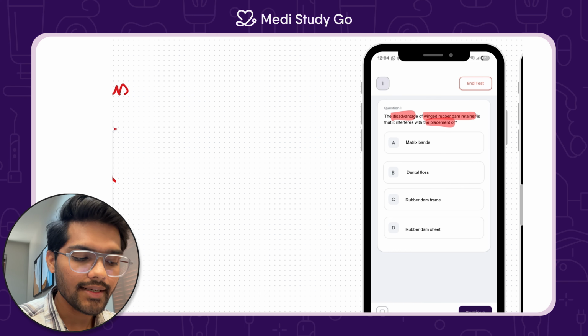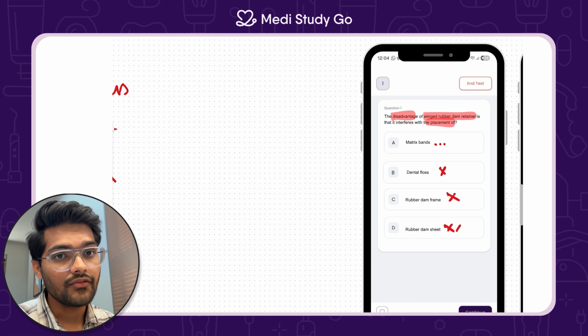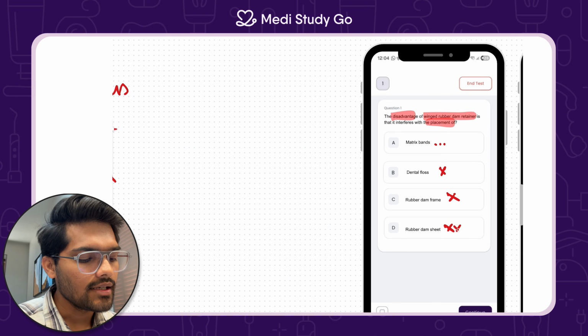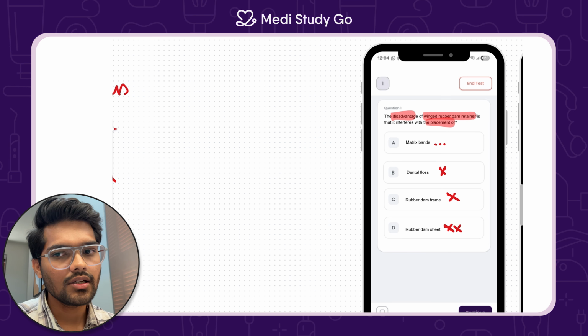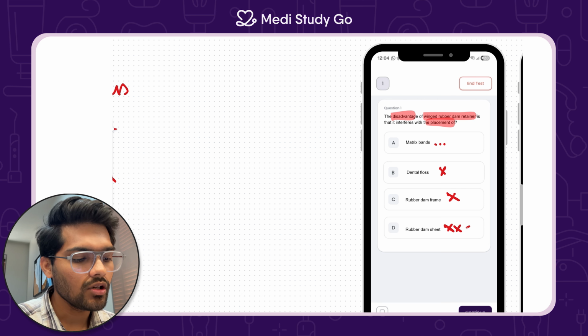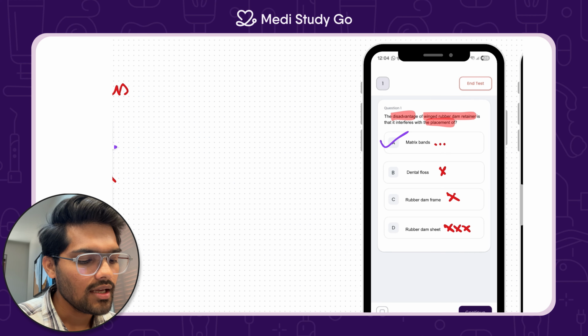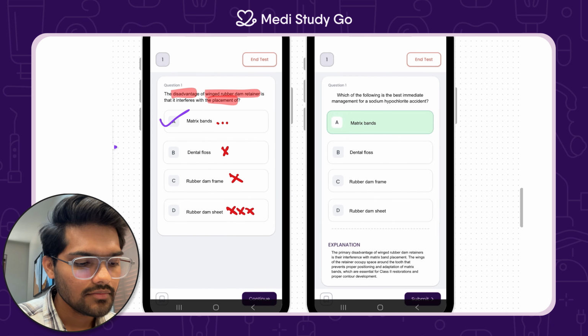The options are matrix band, dental floss, rubber dam frame, and rubber dam sheet. Now, it definitely cannot be dental floss or rubber dam frame, because obviously the frame is outside the tooth, and not even rubber dam sheet, because that is going to go through the teeth no matter what, depending on the thickness and everything. So the only valid option here is the matrix band, and yeah, we're right, matrix band.